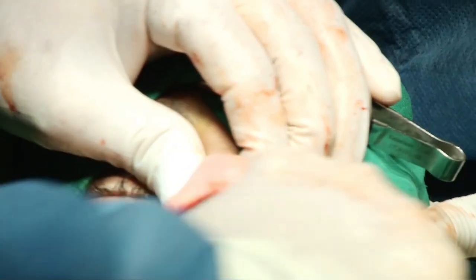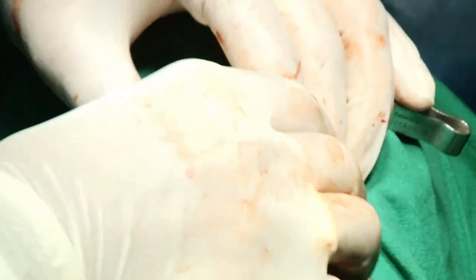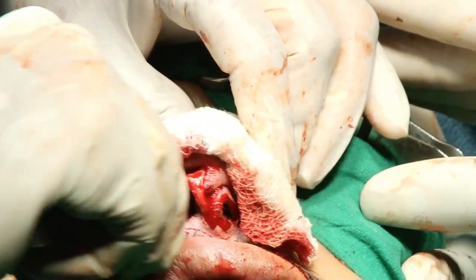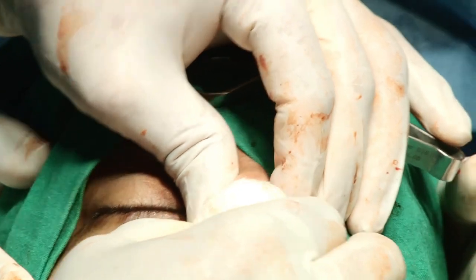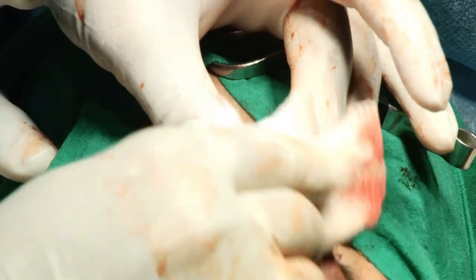So now on the left side, I rotate it anti-clockwise. On the right side, you rotate clockwise. On the left side, that is anti-clockwise. Now the bone mobilizer. This is my blunt bone mobilizer, so I just mobilize the bone, and now the bone is mobilized. So now the nose is straight, more narrow than earlier.